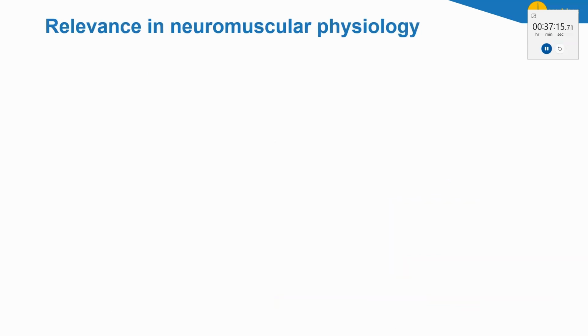What's the importance in neuromuscular physiology? What does conduction velocity tell us?